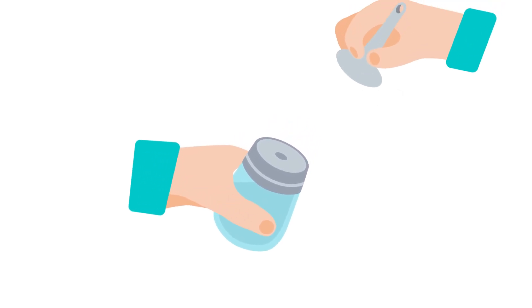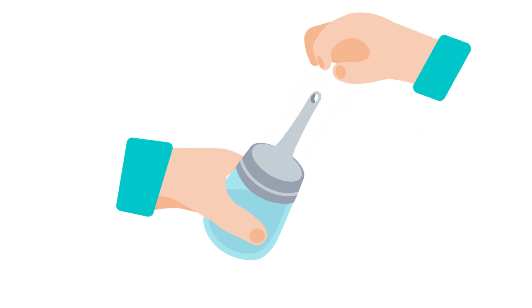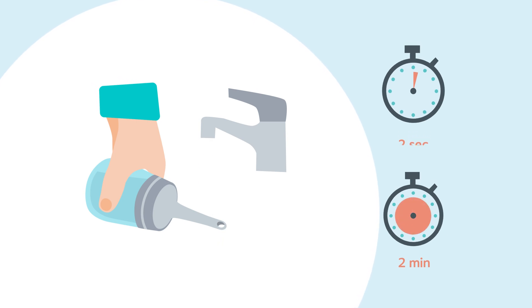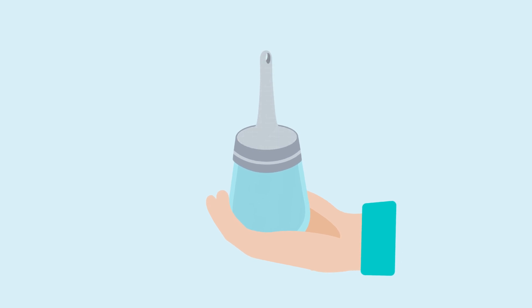Take the catheter out of the packaging and attach it to the lid so the base of the catheter touches the entire surface of the lid. To activate the coating, keep the catheter under running water or bottled water for a minimum of two seconds. Start the irrigation within two minutes to prevent the coating from drying out. The catheter is soft and flexible and has a coating that will become slippery when exposed to water.